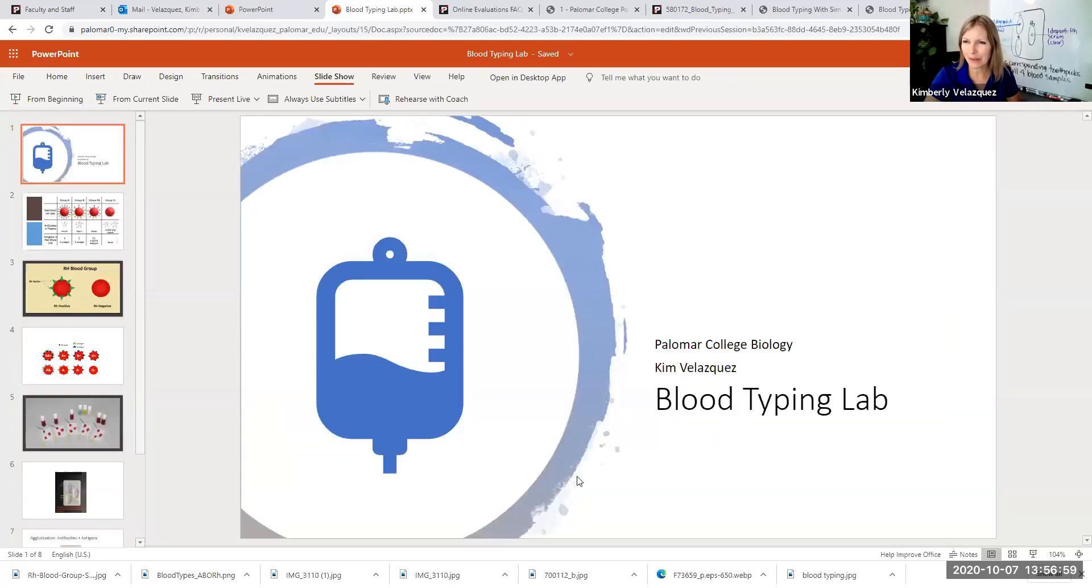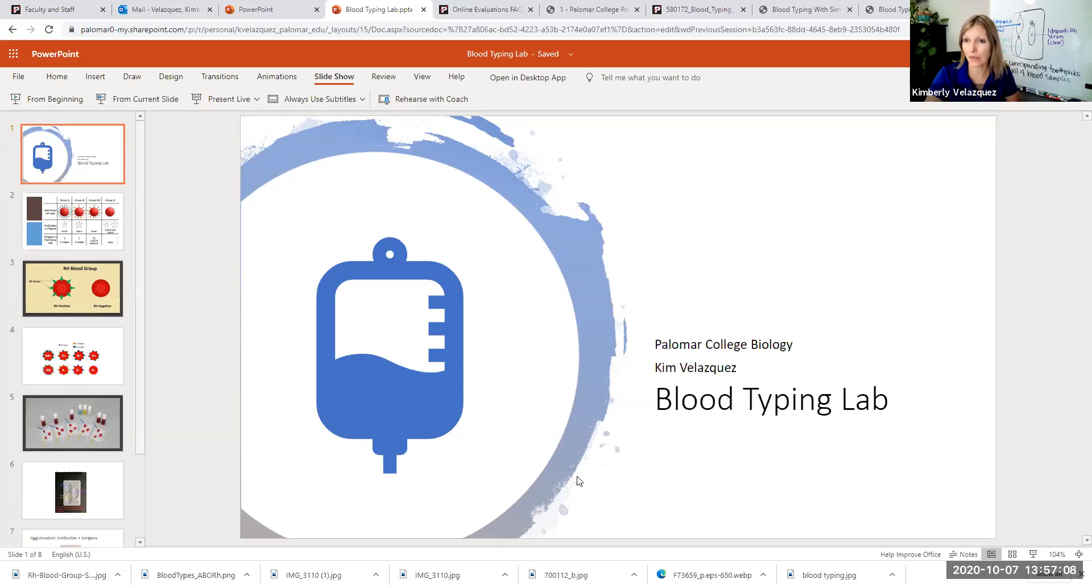This week we are doing the blood typing lab. In this lab exercise you're going to be testing four samples of synthetic blood to determine the blood type for that synthetic blood.